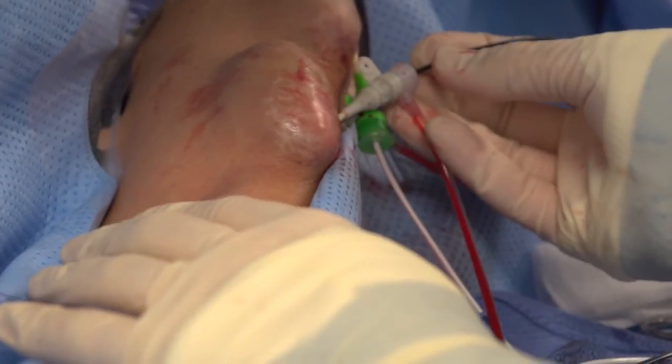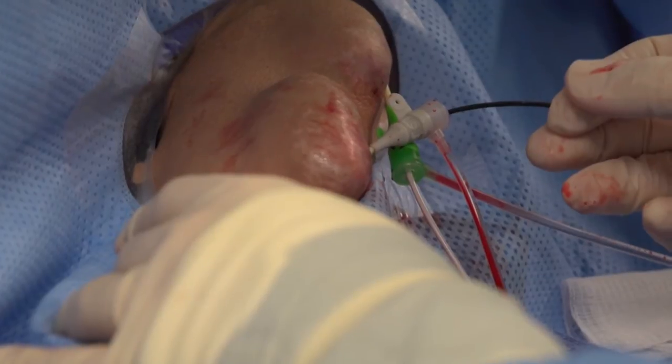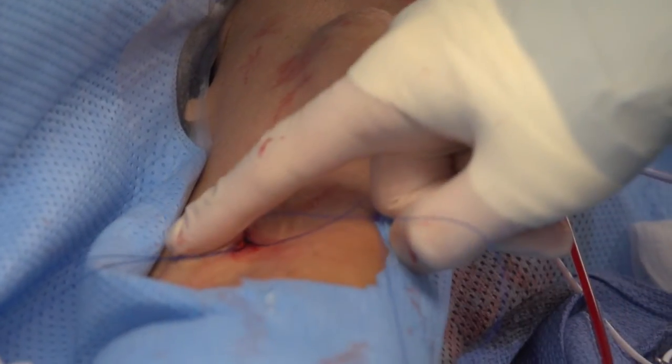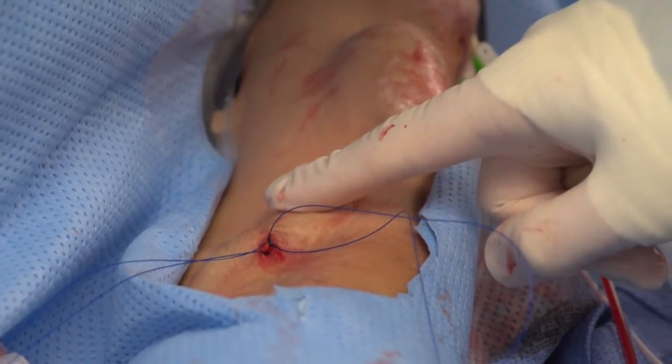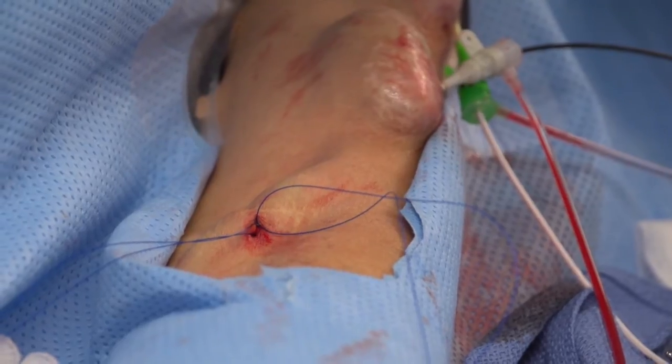We then deflate the balloon and pull it back, then check for flow across the band. The most important thing is to feel a pressure gradient across the band. You can actually see the arterial anastomosis beating stronger than the remainder of the fistula, because we've now created a pressure gradient across the banding area.